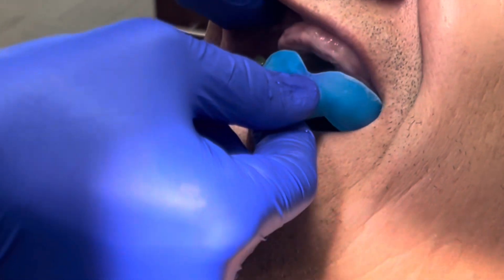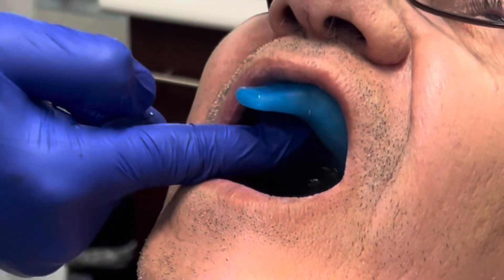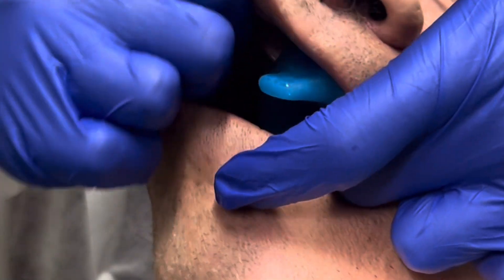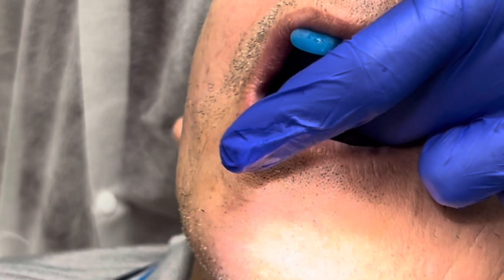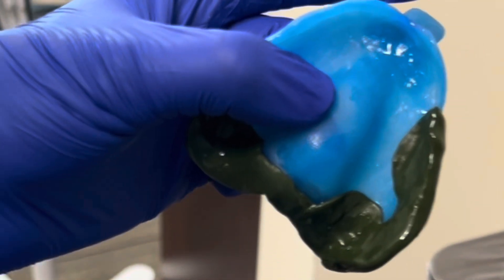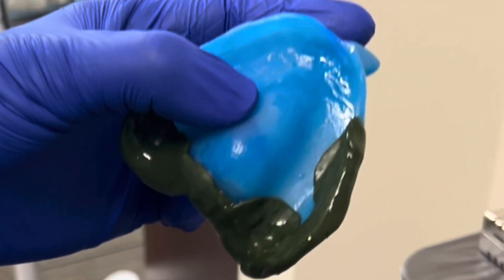We need to watch out during tray insertion not to bend the green stick compound. We then fully seat the tray and start border molding using our hands in a circular motion, also instructing the patient to move their lower jaw left and right. Then we'll take out the tray, revealing the adequately border molded distal buccal area.